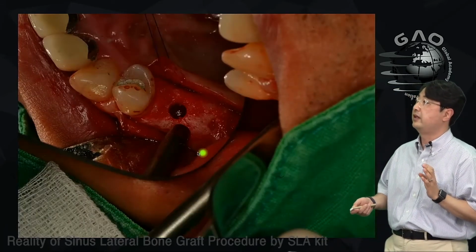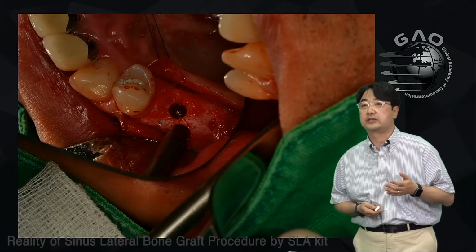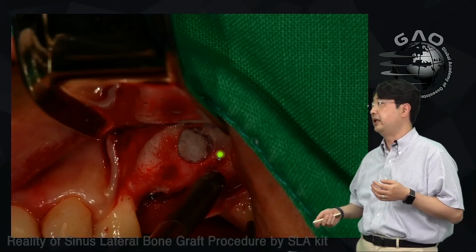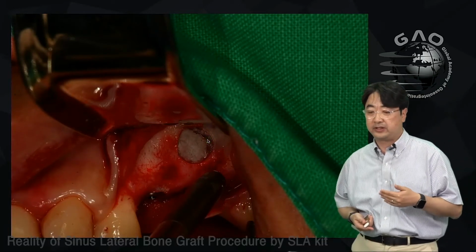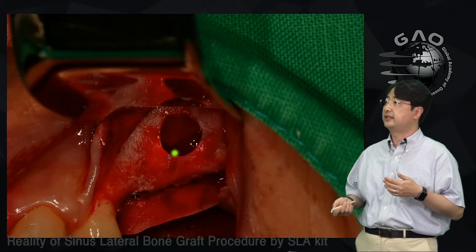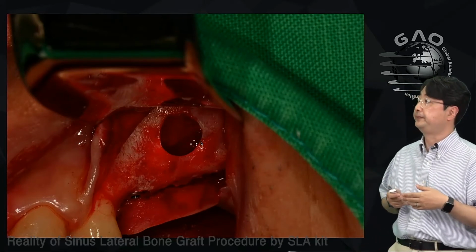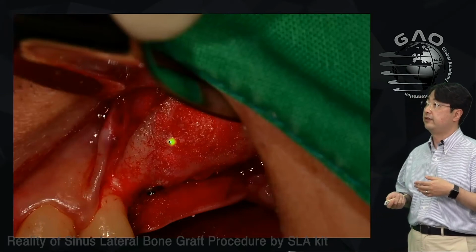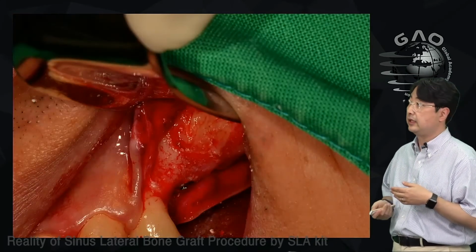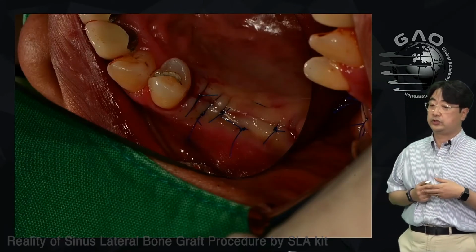This is the number 25 implant site where I did a sinus graft from the crestal approach. And here you can see my window made with the SLA for the posterior implant, for the lateral approach. Okay, so here I dissected the membrane in the same fashion that I showed you in the movie clip. And I did a bone graft, right? Like this, and I placed the implant. Then I covered it with sutures.